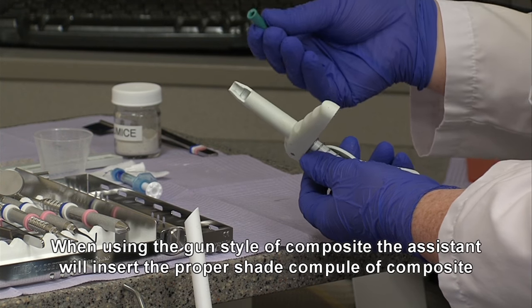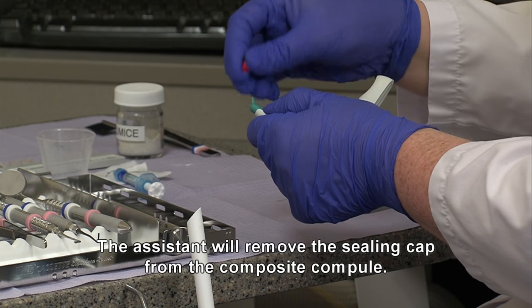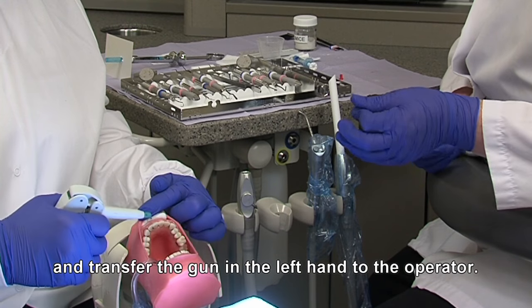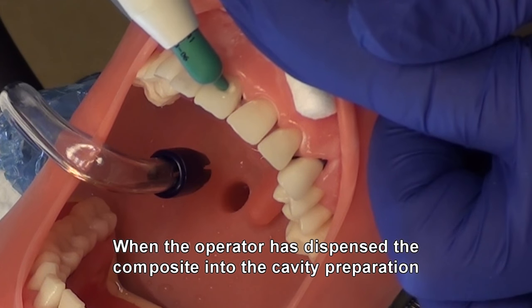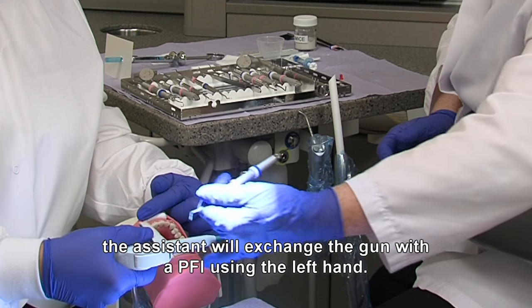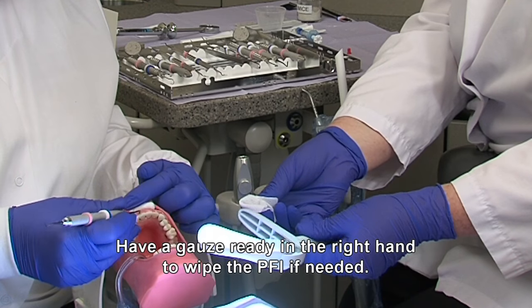When using the gun style of composite, the assistant will insert the proper shade compule of composite into the composite gun. The assistant will remove the sealing cap from the composite compule and transfer the gun in the left hand to the operator. When the operator has dispensed the composite into the cavity preparation, the assistant will exchange the gun with the PFI using the left hand. Have a gauze ready in the right hand to wipe the PFI if needed.